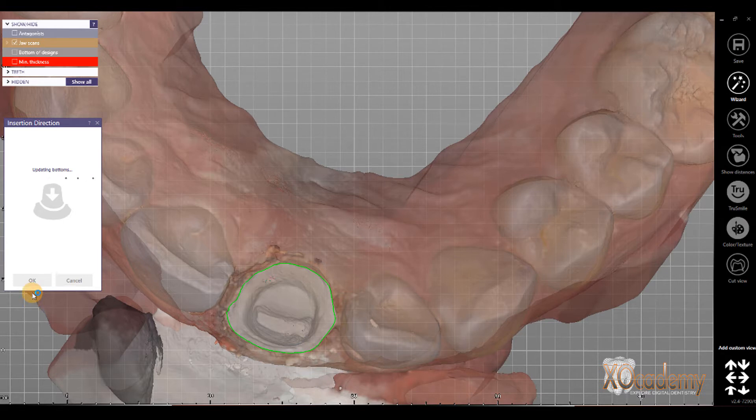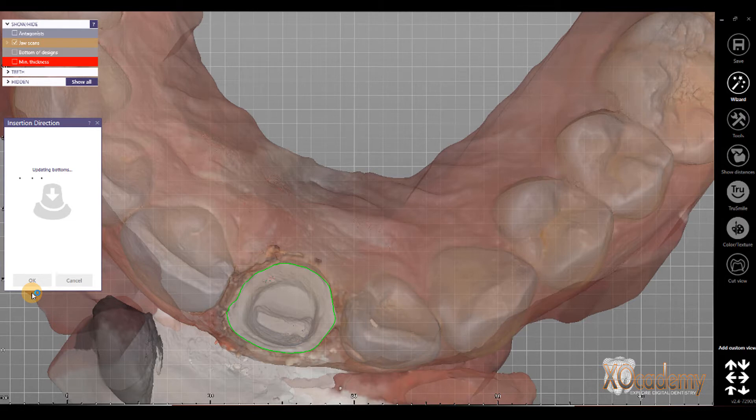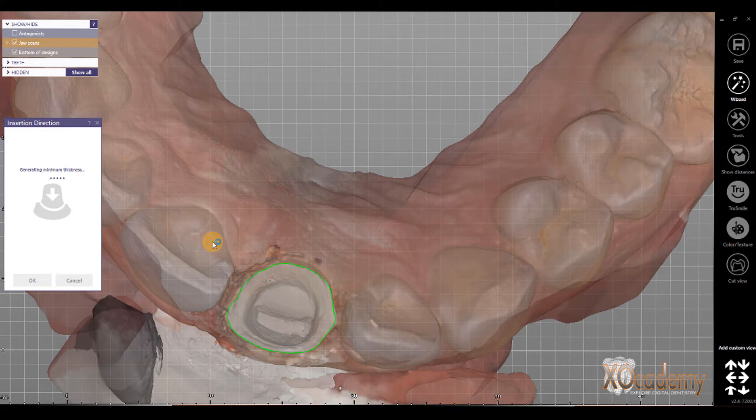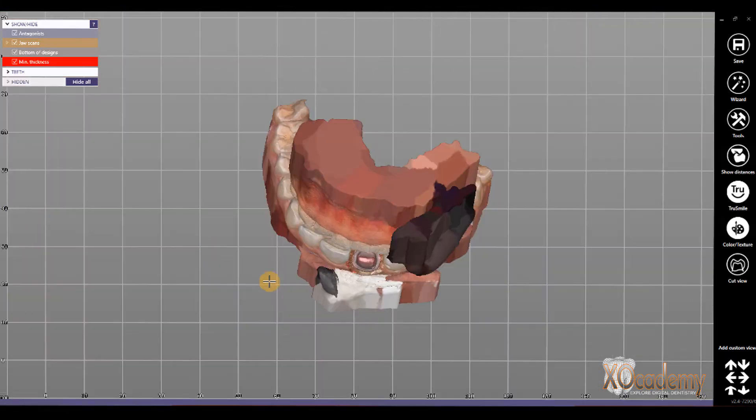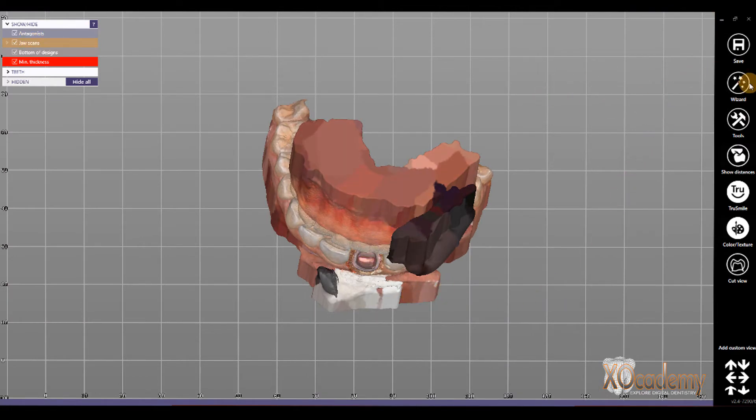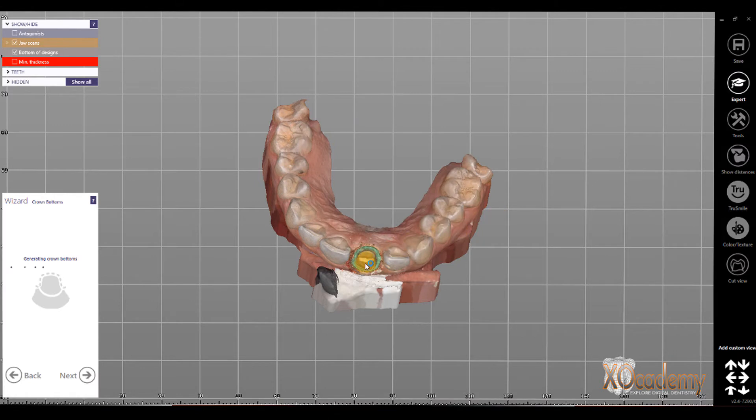Then go back to the wizard, so that first setting that we're going to determine, is the first setting that we're going to change, is always having to do the insertion direction before moving forward with placing our crown. So, I don't want the automatic insertion direction, so that's number 1. So, we go back to the wizard.